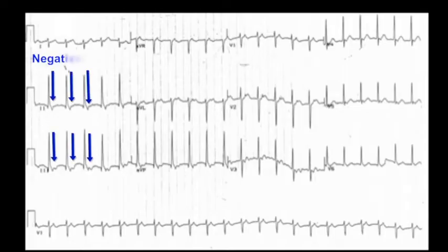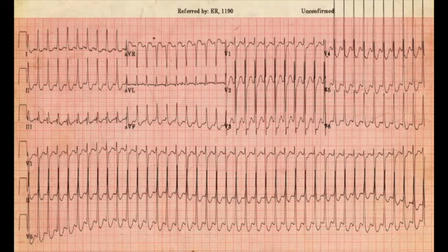The two rhythms in which this will be observed are common AV nodal reentrant tachycardia and orthodromic reentry tachycardia. Orthodromic tachycardia is a reentrant tachycardia that is using a bypass track to conduct an impulse from the ventricle back to the atrium. It is often indistinguishable from AVNRT.